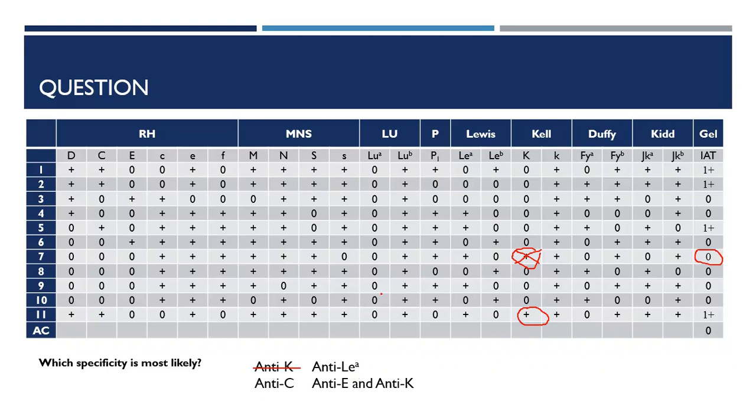Anti-Lewis A, let's do the same thing. Let's find, oh look, right there. That 1 negatively reacting cell also got rid of anti-Lewis A. Well, anti-big K we know is not a possibility because we ruled that out here, but what about anti-big E? Could that be causing it? And let's look here. Here's a negatively reacting cell that is positive, double dose in strength for anti-big E.